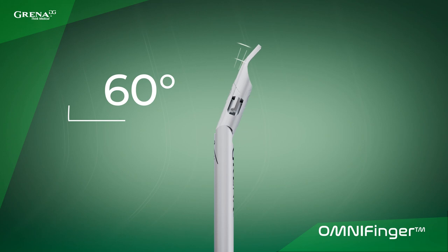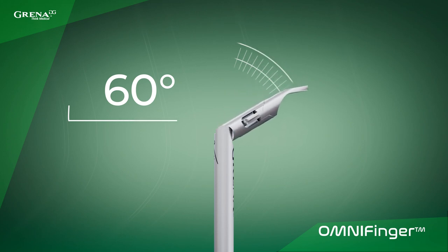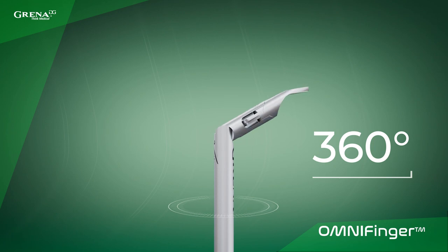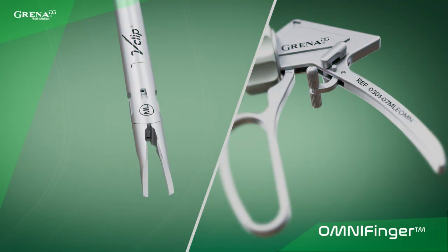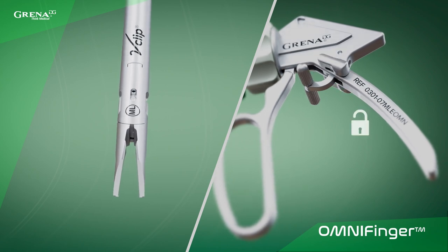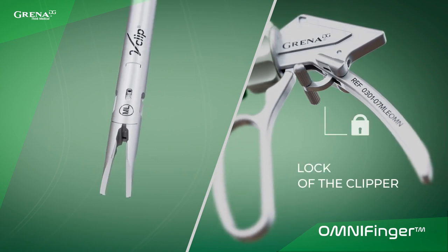OmniFinger provides from 10 to 60 degrees of total angulation and 360 degrees of shaft rotation for the ultimate operator comfort. OmniFinger has a dedicated jaw locking mechanism that makes it totally safe to pass through the trocar with the loaded titanium clip.